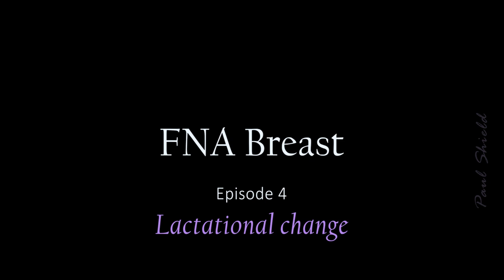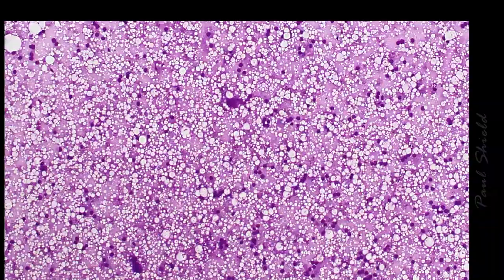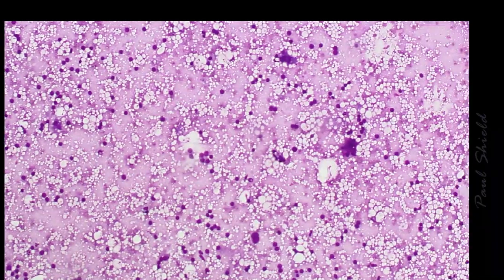So we see this in pregnant patients and in breastfeeding patients. And this reflects a hyperplasia of the terminal lobules of the breast epithelium. Classic pattern here, especially on the Giemsa stain slides. Notice all these clear spaces in the background here. This is all lipid. So this is what we would call a lipid-rich background.